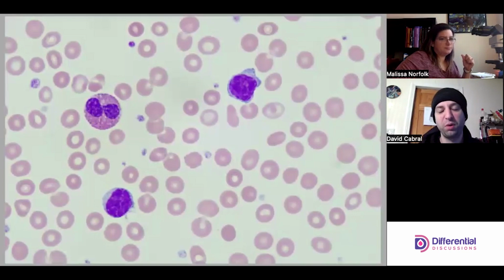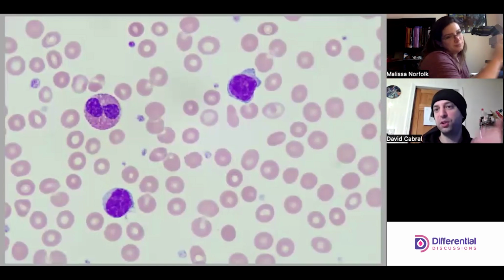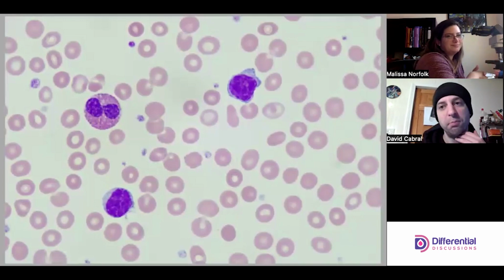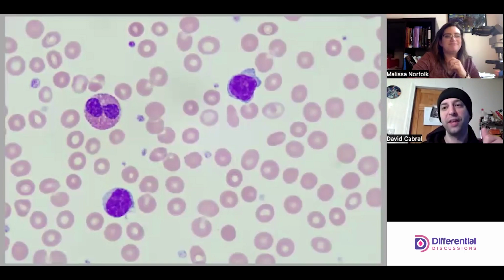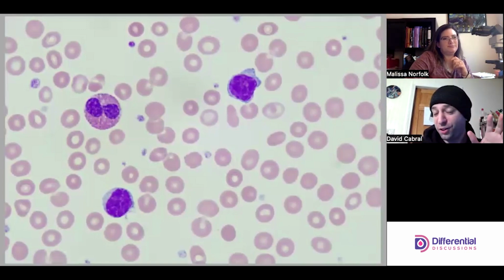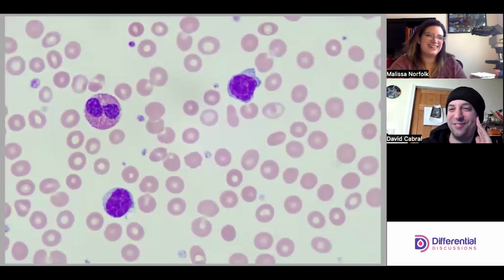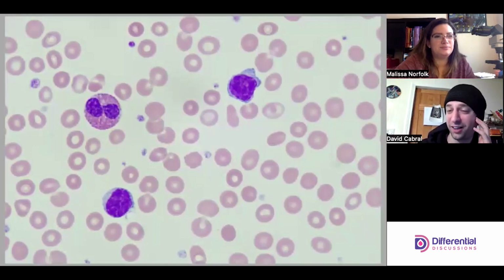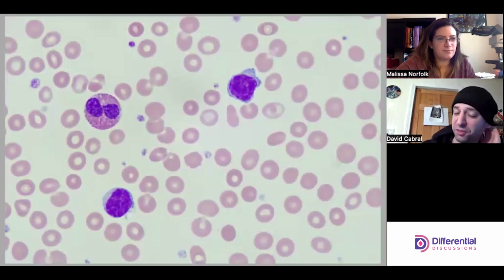Yeah, I agree with you 100%. If we're doing normals, we're speedy and efficient, but when it gets to tricky stuff, we're always ready to start over. I will get to cell 99, see something, and it won't matter. I want to do that diff again with that greater insight. And I know for our student training techs, losing that time doing your diff is incredibly painful because it takes you a while, but it's the right thing to do, and it's a great habit to get into. Thank you, Melissa, for bringing that up. It's important.